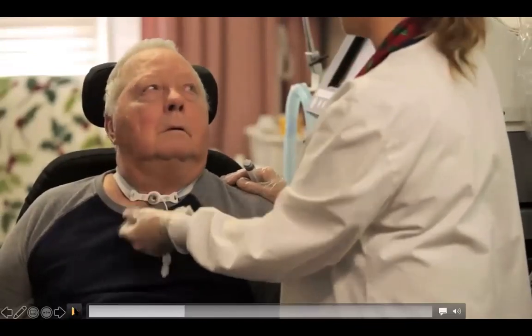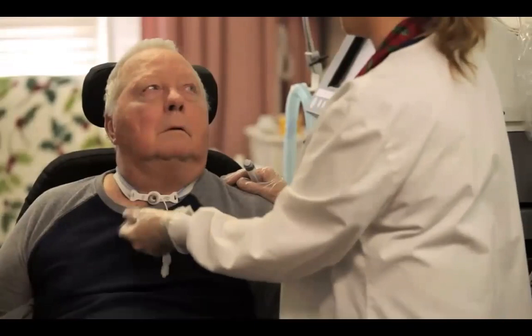Off. There's some. Okay, so she just did the digital occlusion to sense if there's any backflow or pressure against her finger. The patient was able to voice and say ow, which just tells you that the air escaped to the upper airway.